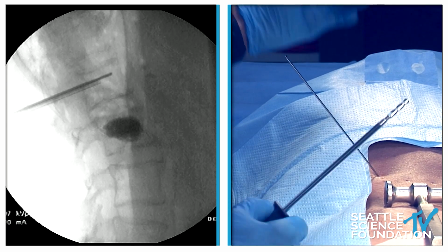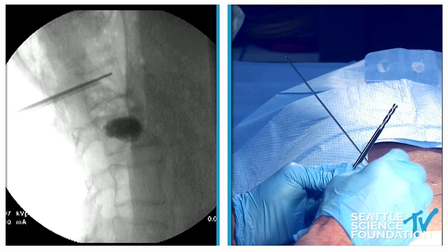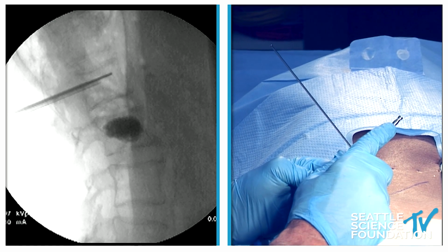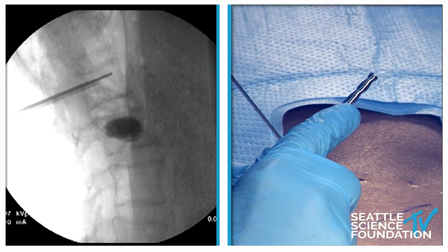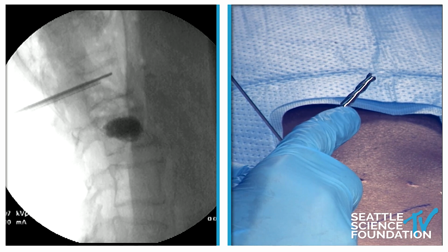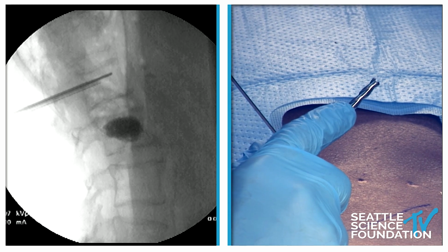And over this, I'm going to put a rotating reamer. This reamer is very sharp on the end. So this is self-tapping. It's also fluted and the ridges on the side are also sharp. So this is not really necessarily a drill. It has sharp edges, self-tapping, and this is a very aggressive tool. It's also size matched. We have a blue on the handle. We know this is a 5/0 spine jack.